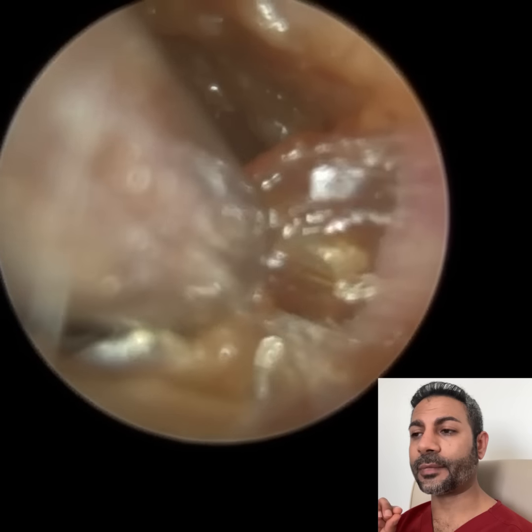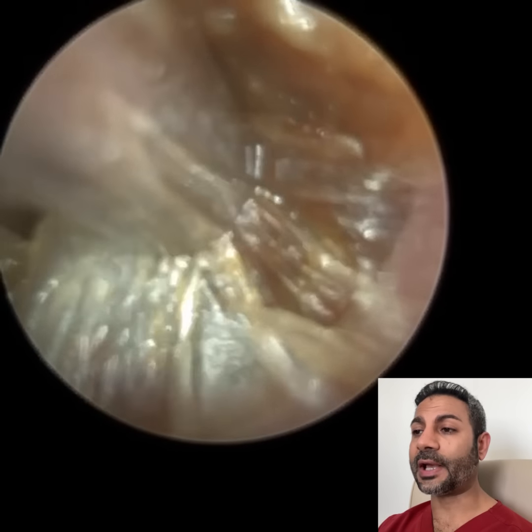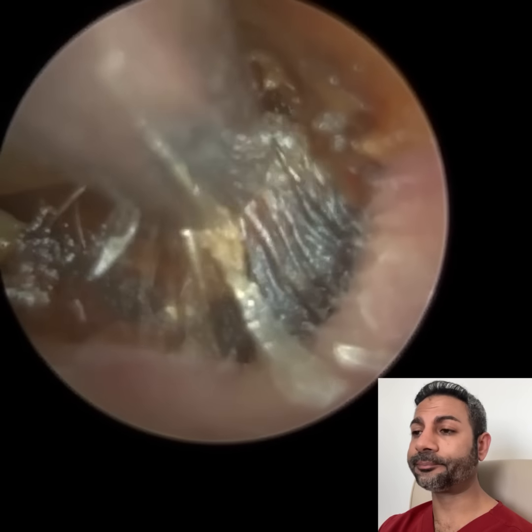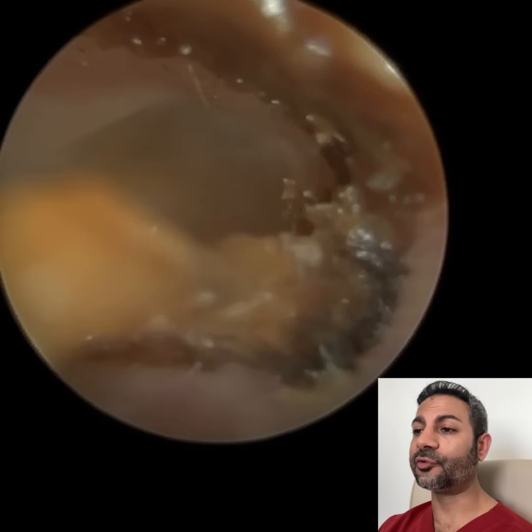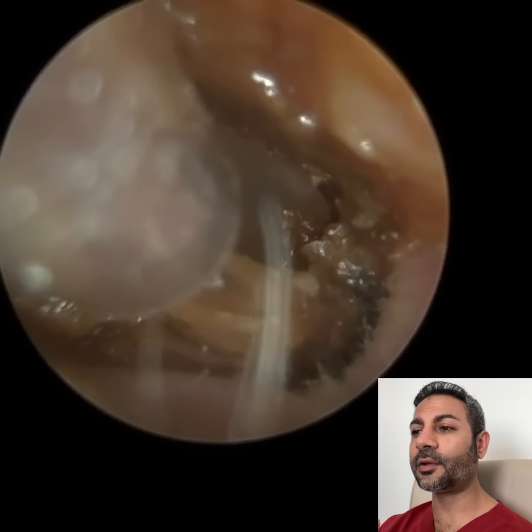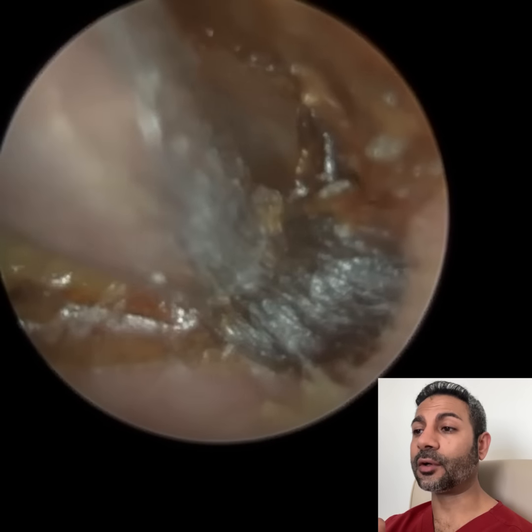They do still require regular cleaning, because in that region now, you'll see, once we clean this, there is an erosion there, widening. But fortunately, there's no ulceration, and there's no discharge in that region. There's no exposed bone. This patient is quite young, so there's another potential differential diagnosis, which is a benign osteonecrosis.